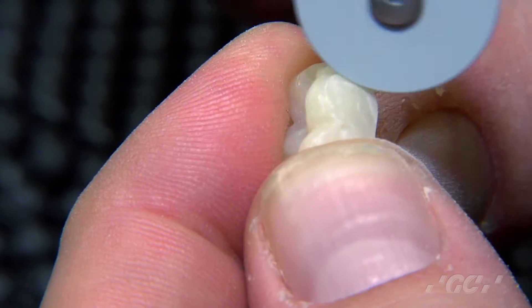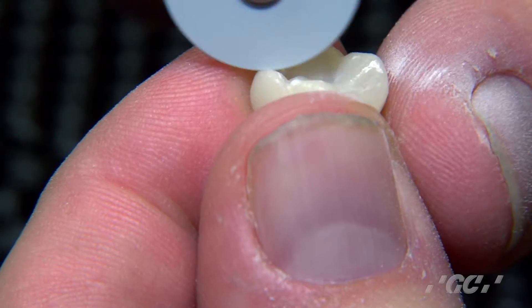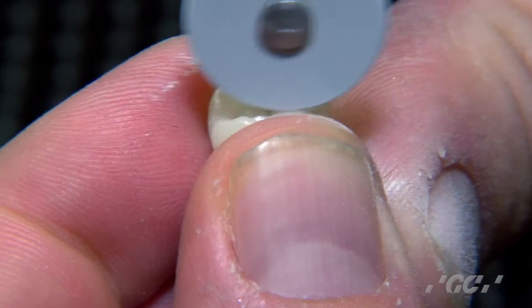Just very lightly — not pressing too hard. We don't want to destroy the margins or take away any of the anatomy on the occlusal. Just get rid of those burr marks.